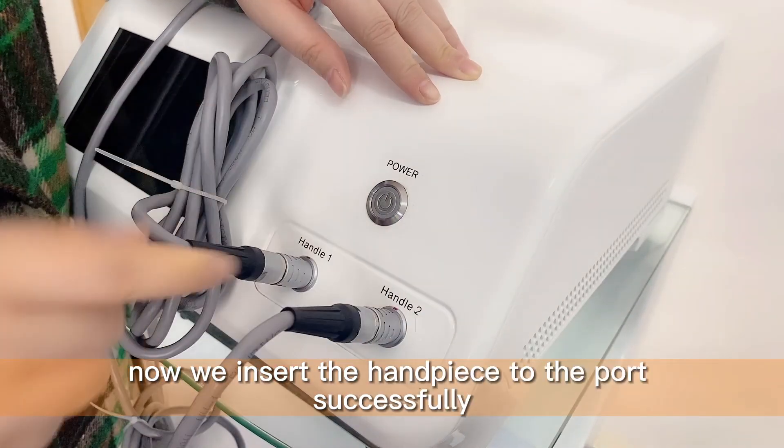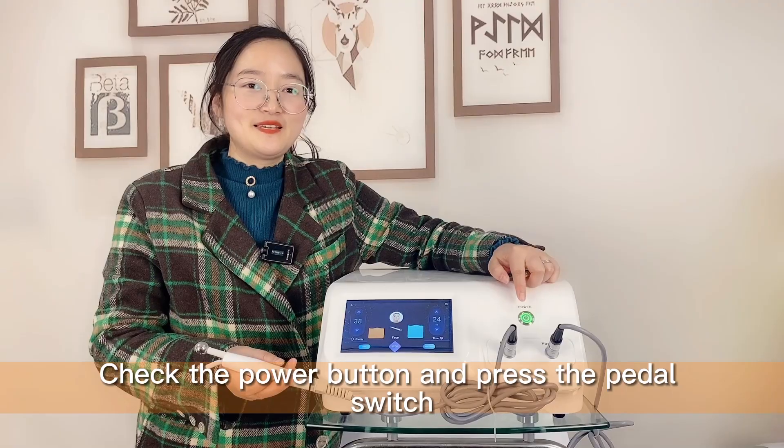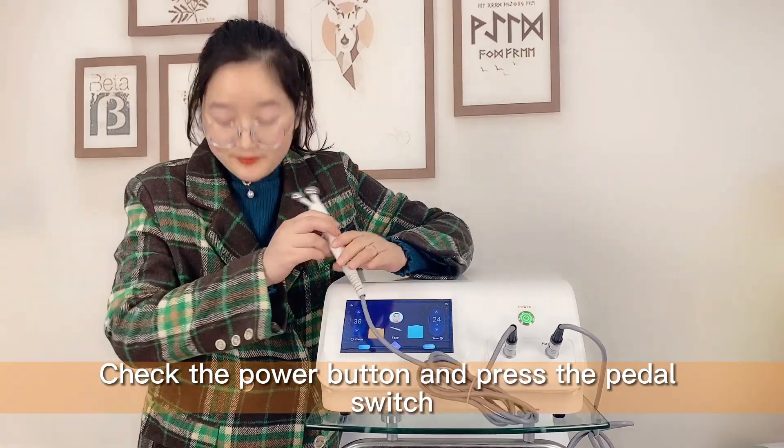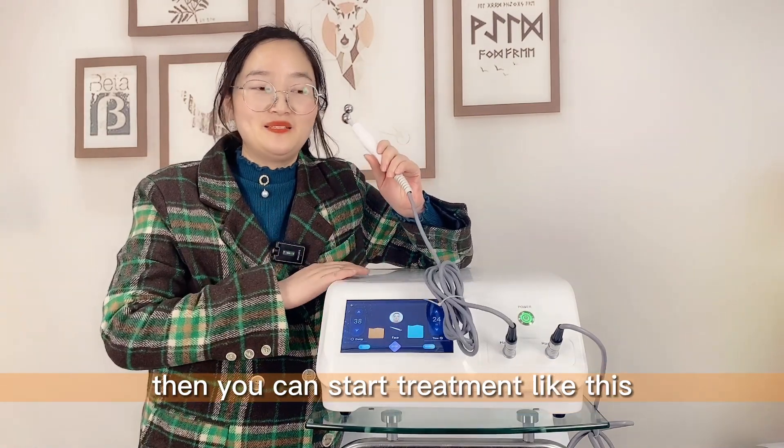Now we insert the handpiece to the port successfully. Check the power button and press the pedal switch. Then you can start the treatment like this.